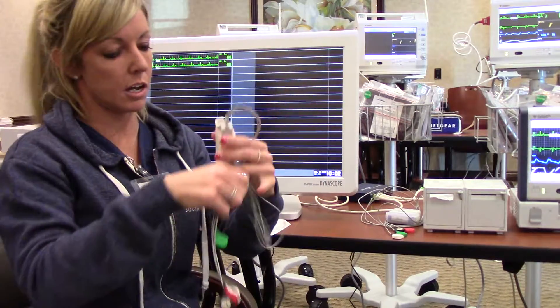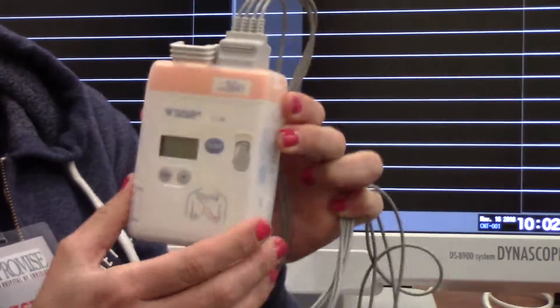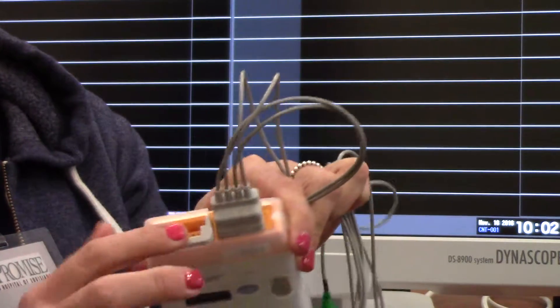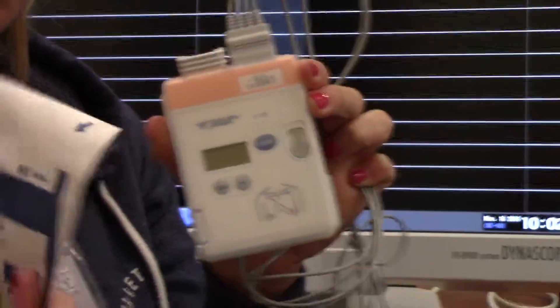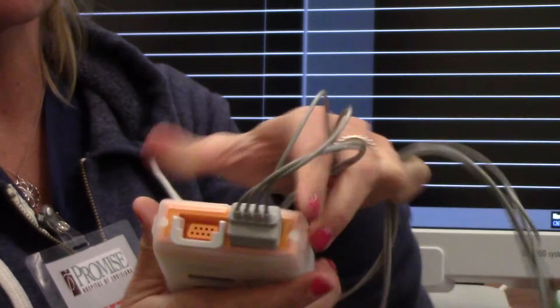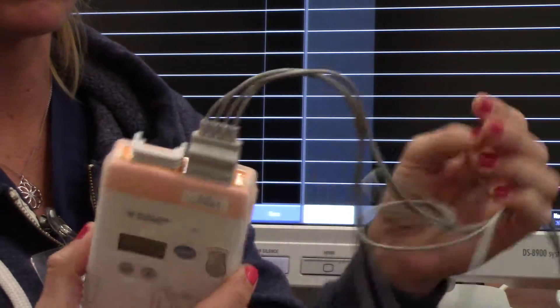There's a second EKG or telemetry box, a little bit bigger unit. The difference with the orange telemetry box is that it can monitor ECG, respiratory rate, and oxygen saturation. As you can see, you have a second port that requires the Nellcor oxygen saturation probe to be inserted in the top. This unit is also waterproof as long as both ports are connected — it is not waterproof if either of the cords is not connected.